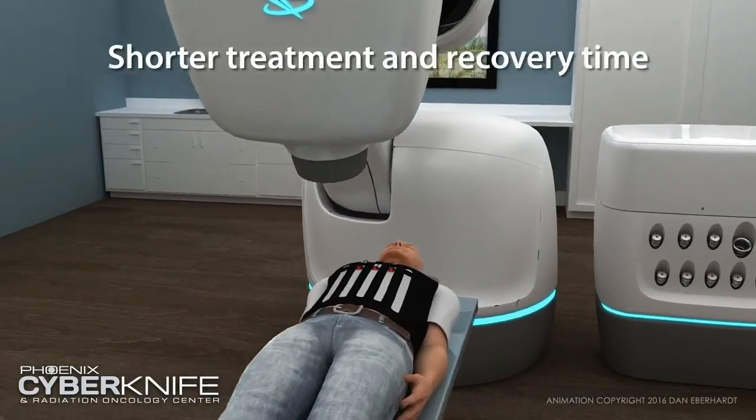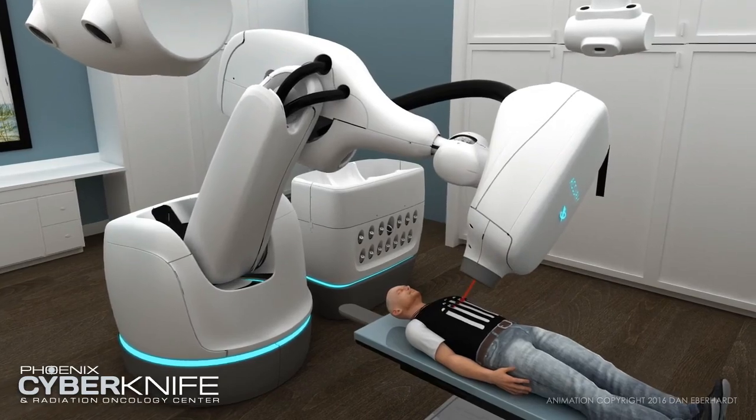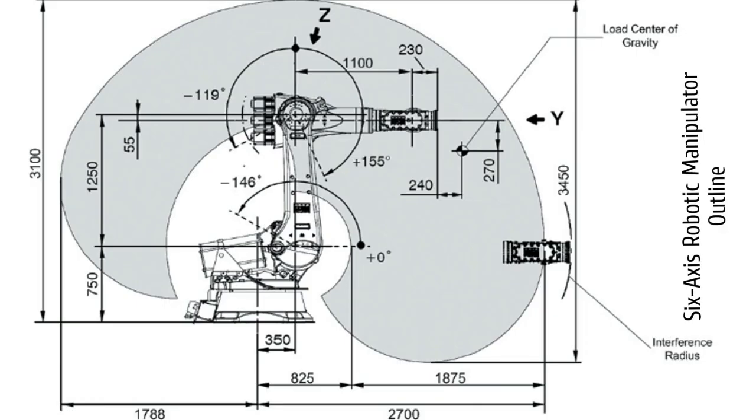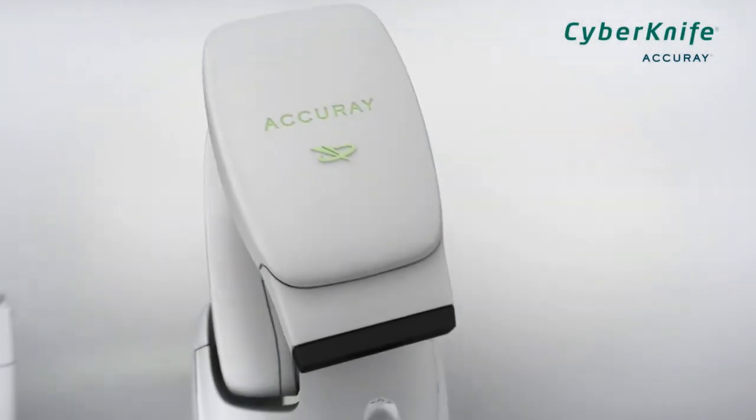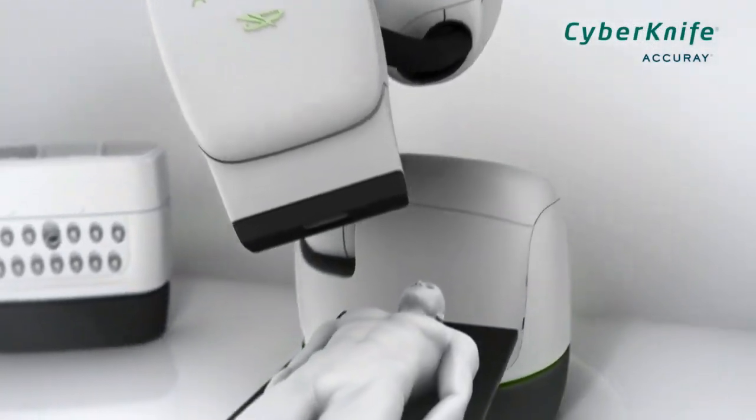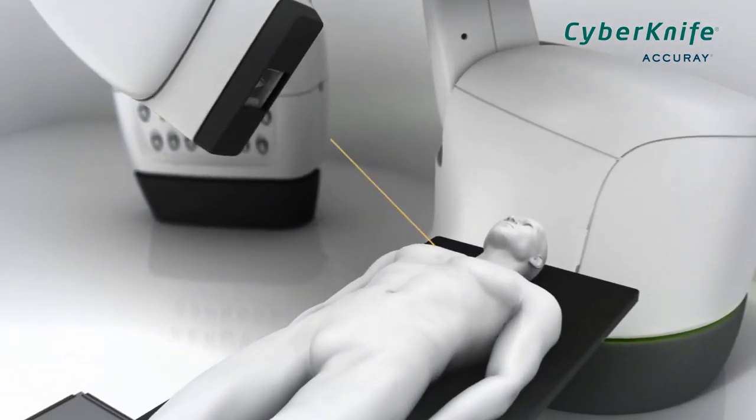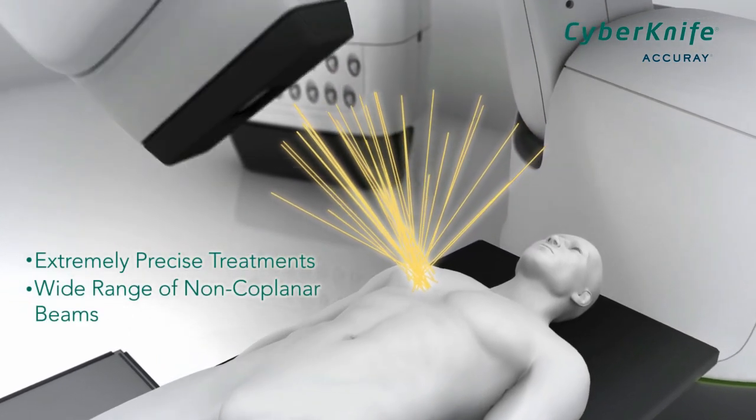First, let's understand the 6-axis robotic manipulator. The CyberKnife system utilizes a 6-DOF robotic manipulator to position the LINAC in space and deliver a dose. The robotic manipulator is programmed to move in a fixed and predetermined workspace. The designed workspace accounts for the positions of objects in the treatment suite, including the treatment couch, the imaging sources and detectors, the floor and ceiling, and eliminates collision hazards by creating suitable paths for the robotic manipulator to move in.